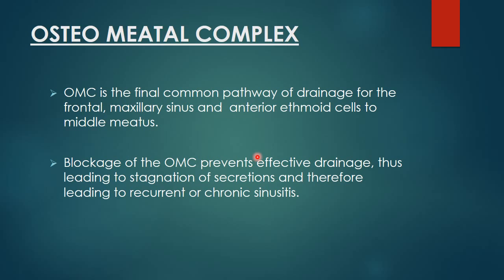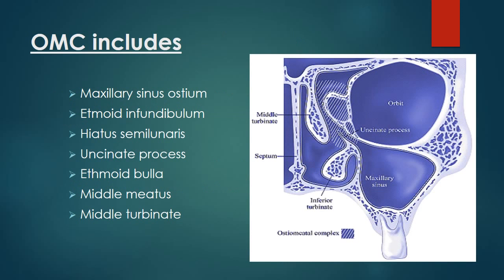Coming on to the osteomeatal complex: it is the final common pathway of drainage for the frontal, maxillary, and anterior ethmoid cells to the middle meatus. All these sinuses drain into the middle meatus through the osteomeatal complex. Blockage of the osteomeatal complex prevents effective drainage, leading to stagnation of secretions and therefore recurrent or chronic sinusitis. The osteomeatal complex is not a single anatomical entity; it consists of the maxillary sinus ostium, ethmoid infundibulum, hiatus semilunaris, uncinate process, ethmoid bulla, middle meatus, and middle turbinate.